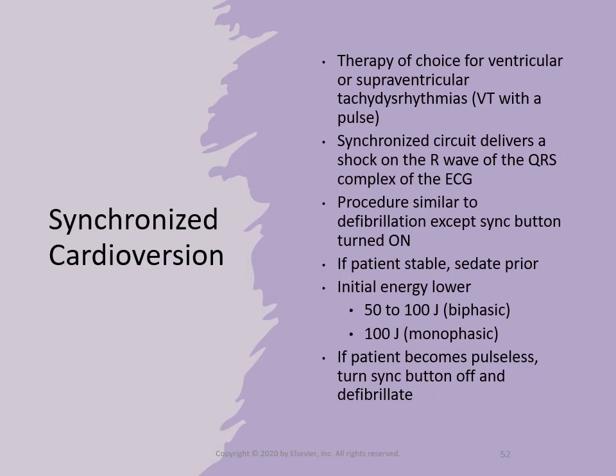You can also use synchronized cardioversion to change a rhythm. However, we use it on rhythms that have a recognizable pattern and patients who have a pulse. The procedure itself is very similar to defibrillation. The difference is you engage the sync button on the defibrillator rather than make sure that it's turned off as you did with defibrillation.